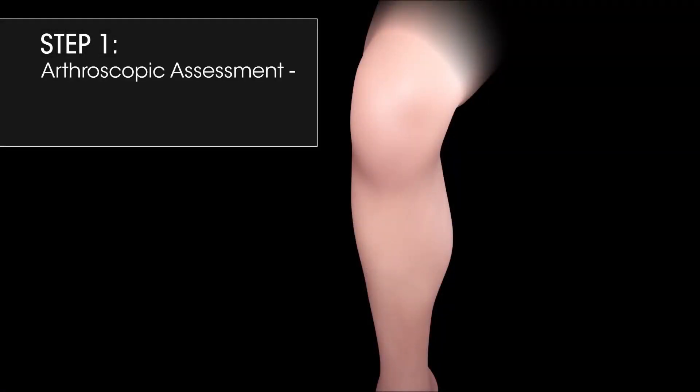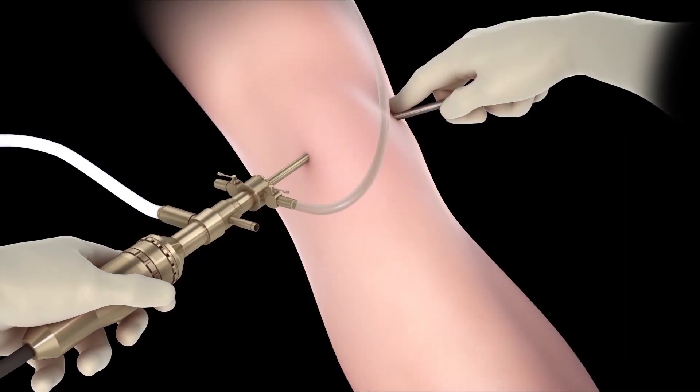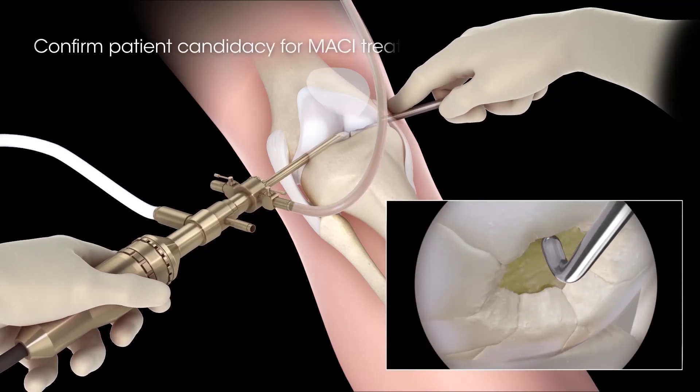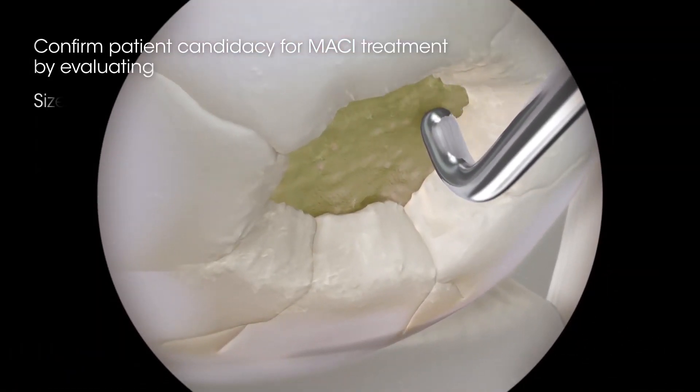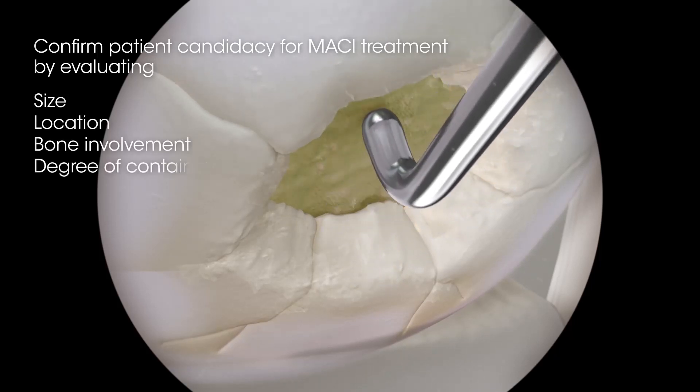Step 1: Arthroscopic Assessment — Determining Defect Size and MACI Candidacy. During an arthroscopic assessment and prior to biopsy harvest, confirm patient candidacy for MACI treatment by evaluating size, location, bone involvement, and degree of containment.